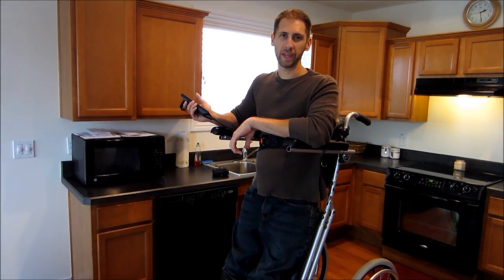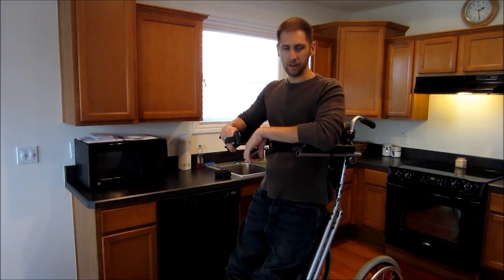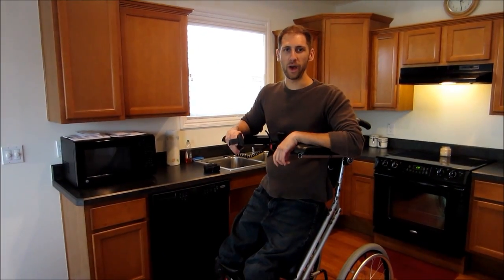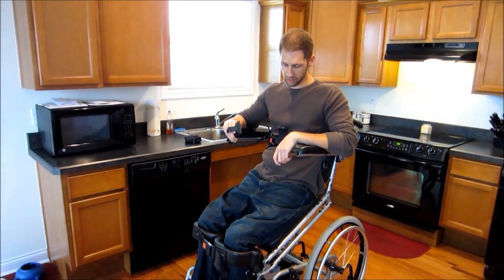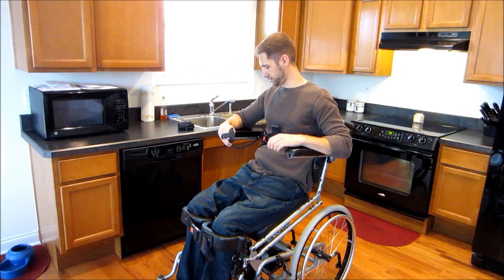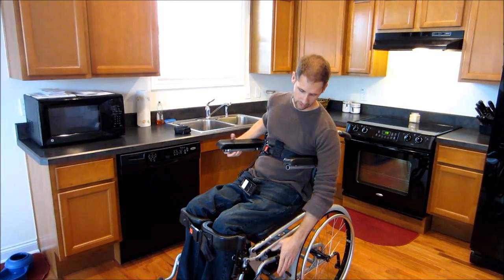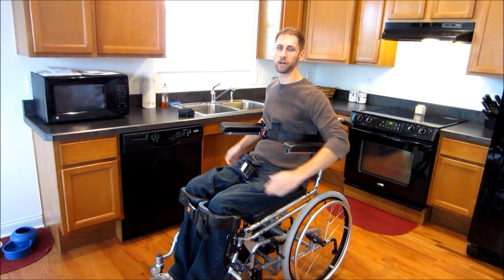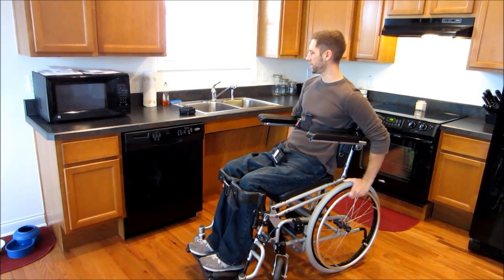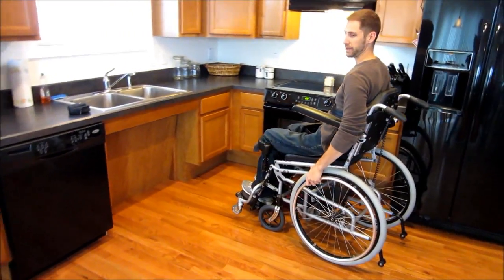So say I want to go over to the counter and get into the cabinet. All I have to do is lower it down. I actually don't even have to lower it down all the way. As long as I can get to the wheels itself, I can wheel around. So I usually lower it about to that point, pop the brakes off. The brakes I really don't need to keep on even when I stand up. I just had them on initially because it helps with the transfer.